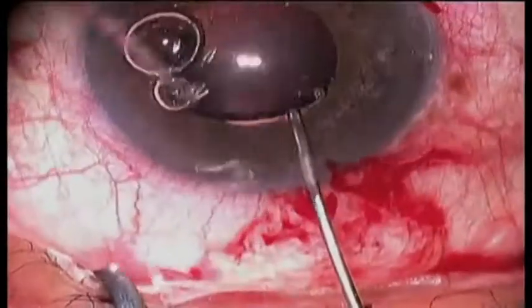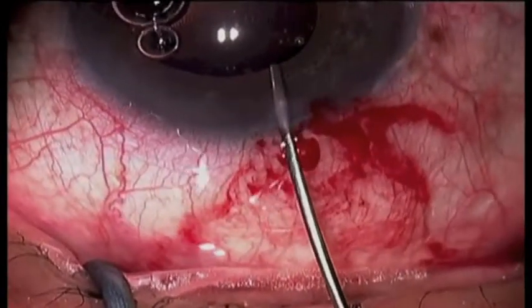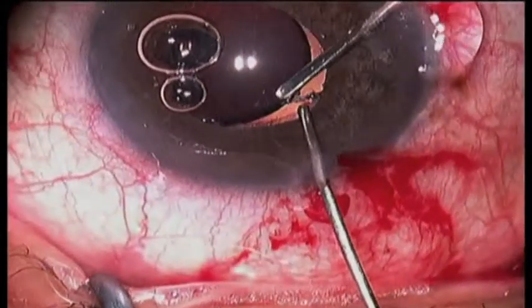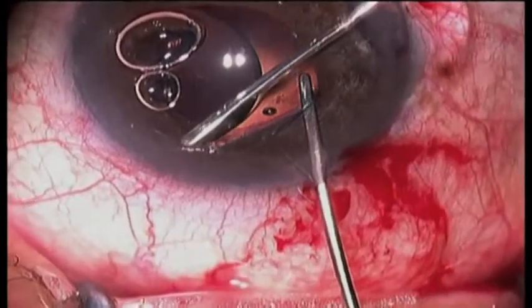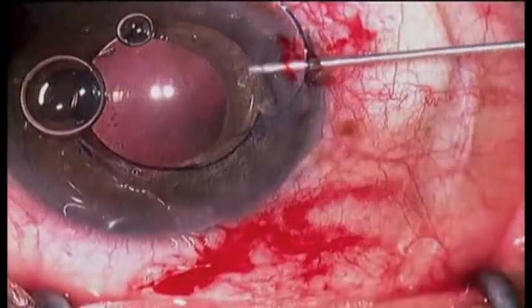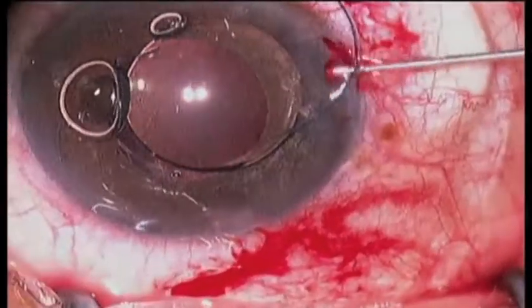viscoelastic is placed in the anterior chamber and the lens is elevated out of the ciliary sulcus into the anterior chamber, where it can be grabbed and cut using the MST forceps and micro cutters.